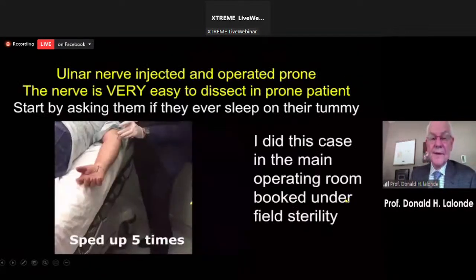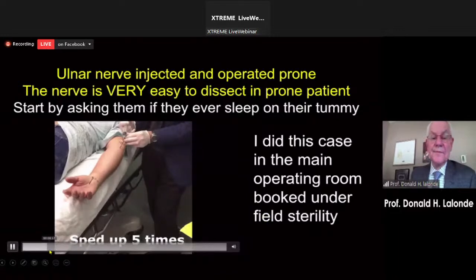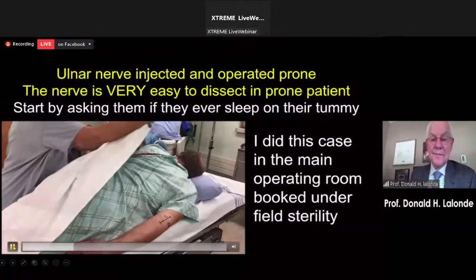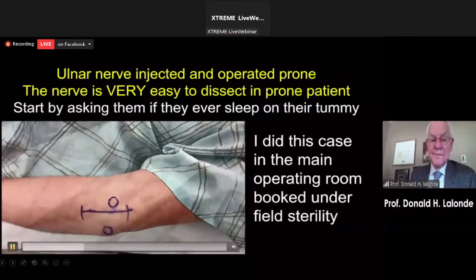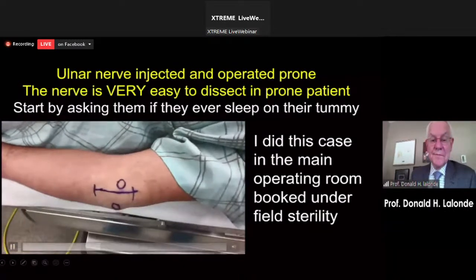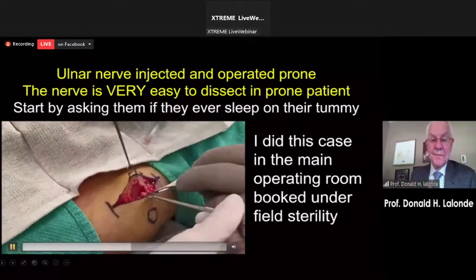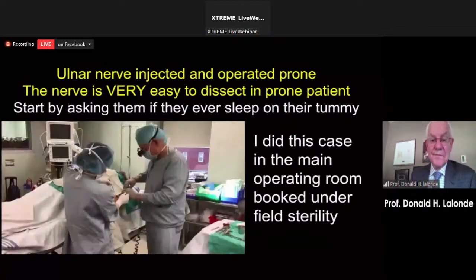If the patients are comfortable with injection of the cubital tunnel on their abdomen, we go ahead and do their surgery on their abdomen. For people with sore shoulders, sometimes this is a good option. The other advantage of it is that the visibility of the ulnar nerve in the prone position is really excellent. We actually did this particular case in the main operating room with field sterility. In our city, we are allowed to do main operating room cases with field sterility because we have proven to our administration that this is safe.